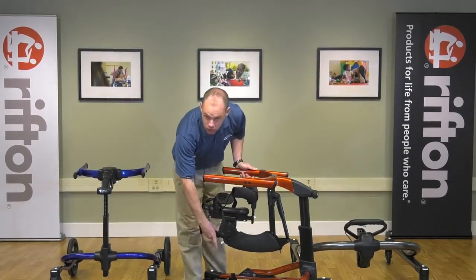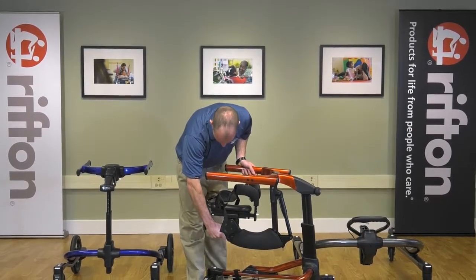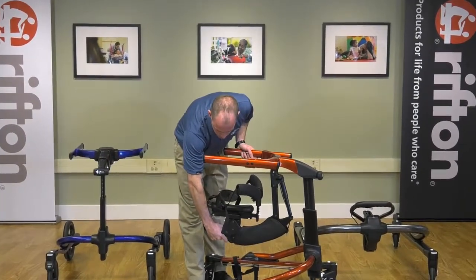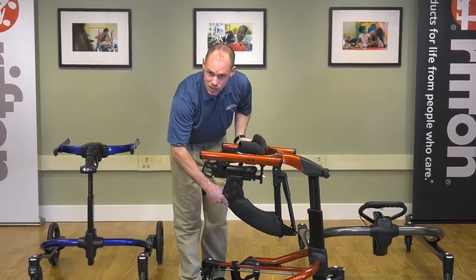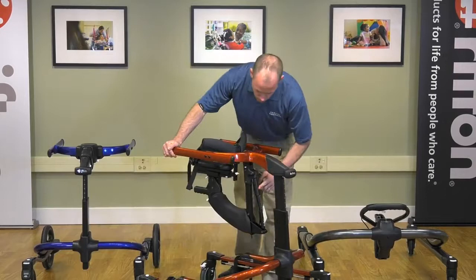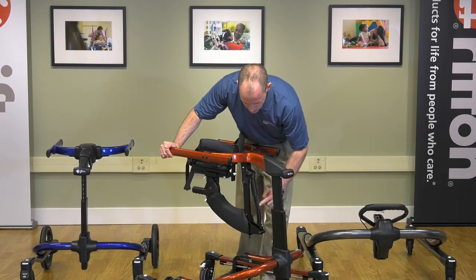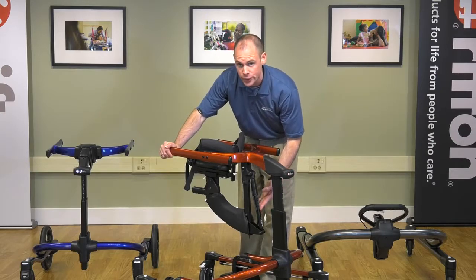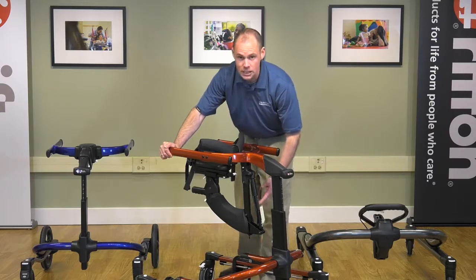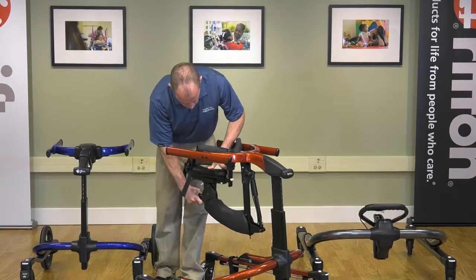So first of all, you can adjust the height with this white lever down here. And it goes from its bottom position and moves all the way up through 8 inches of range in height. The multi-position saddle height adjust also has height indexing marks along the front. So again, you can record the optimal height for a given client in the multi-position saddle. So that should be very useful to you.